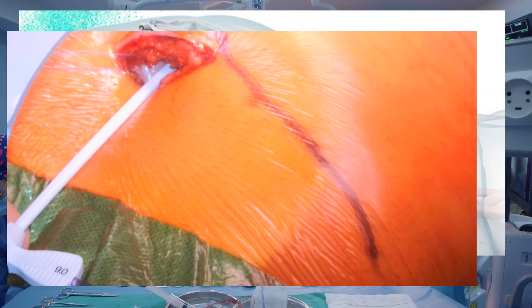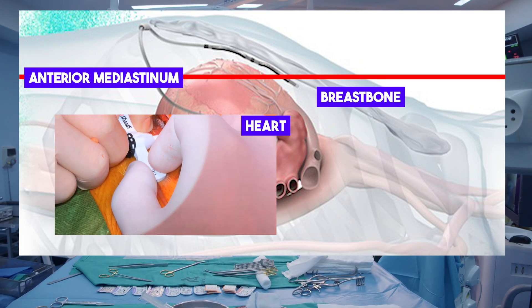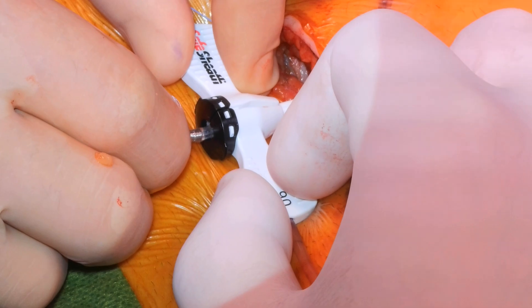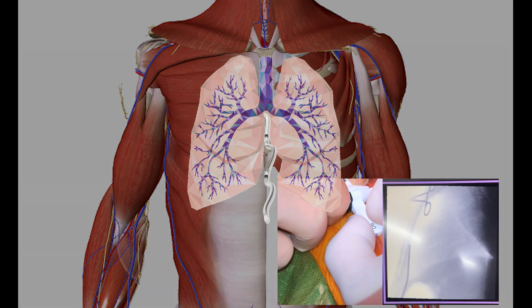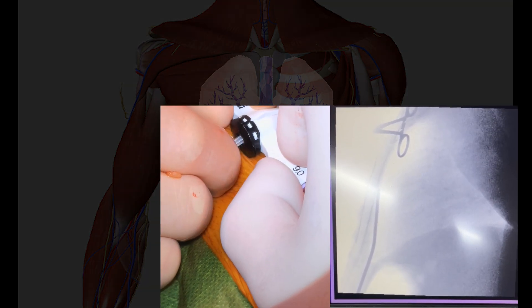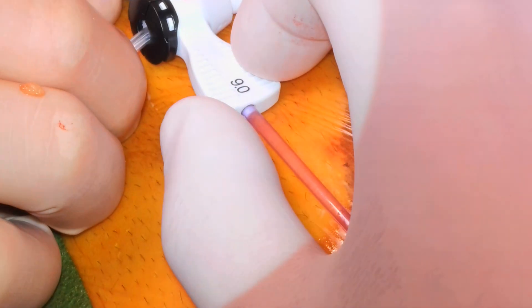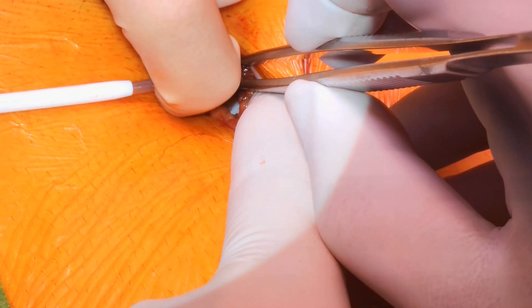Next, we introduce the external tunneling tool, designed to deliver a hemostatic peel-away introducer of 9 French diameter to place the lead into the anterior mediastinum, behind the breastbone, and right over the heart. Once the external tunneling tool is in position, we carefully guide the lead under fluoroscopy-guided vision until we reach the bifurcation of the carina. At this point, we begin to retract the external tunneling tool until a blue spot is visible.